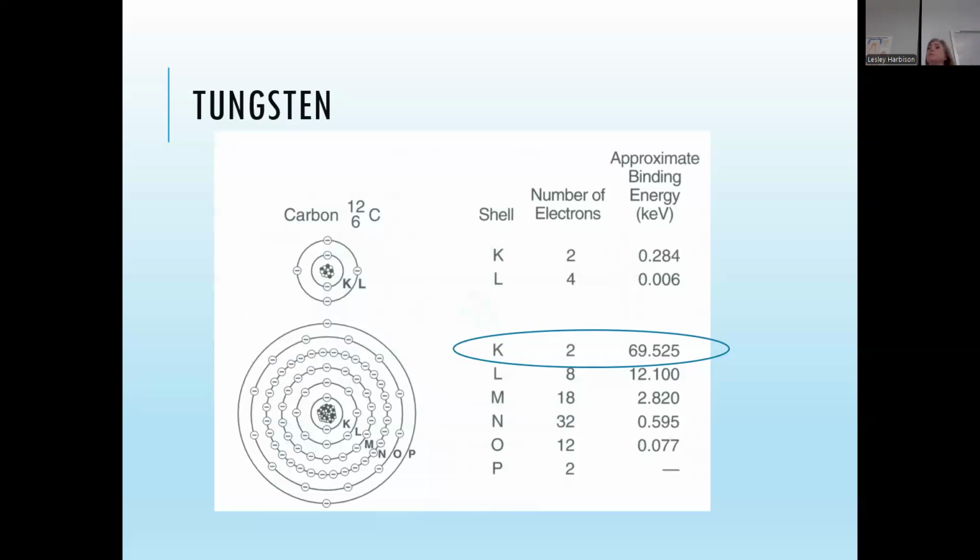So are you saying it's just by chance when we take an X-ray that we get either characteristic or Bremsstrahlung? Well, ours are all set at 70. I do think that when I first got this course, the notes said we only make characteristic. But then I dug into it, because people would ask me, do we only make characteristic? And I'm like, well, is it impossible to make Bremsstrahlung?